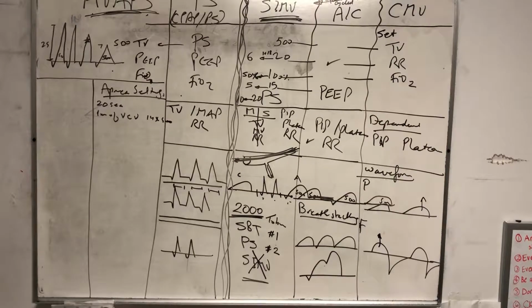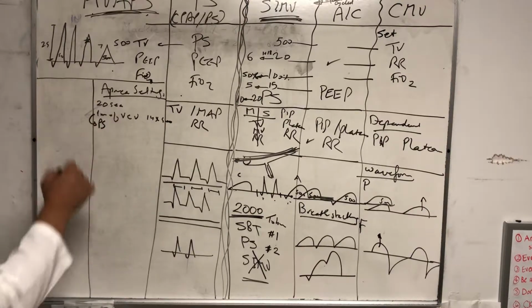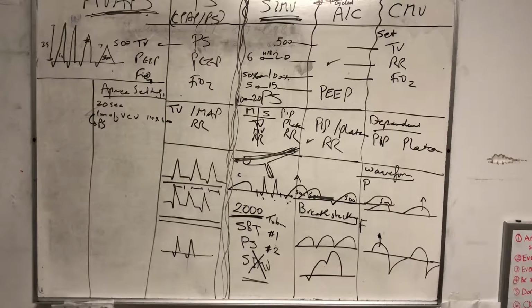And then after the 1 minute, it will put you back in pressure support again. And if you don't breathe again for 20 seconds, it will do it again. That's for safety. So that's great, unless you're trying to do an SBT, and it happens so frequently, and it's very difficult to convince respiratory therapists otherwise. I think I've made maybe 50% success in this hospital where I live, right? But still, there is a lot of culture behind this, and they can't tolerate patients who are apneic.